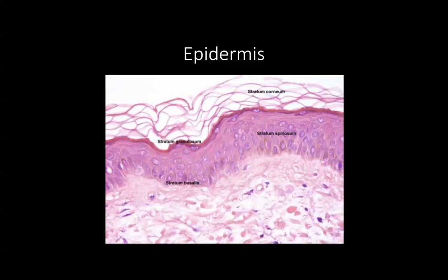And it's quite fascinating to see the little lines, spiny processes between the keratinocytes during spongiosis. It's one of the fascinating parts of cell biology to think that all these keratinocytes are really networked together through these intercellular proteins that are really pronounced during spongiosis. So that's the stratum spinosum layer.